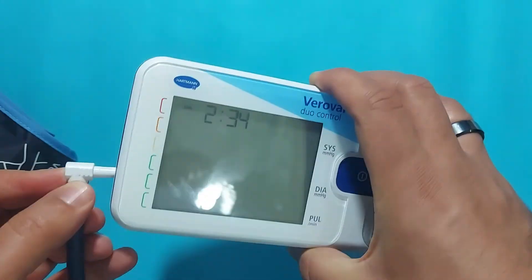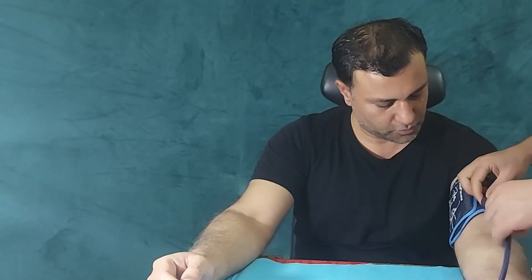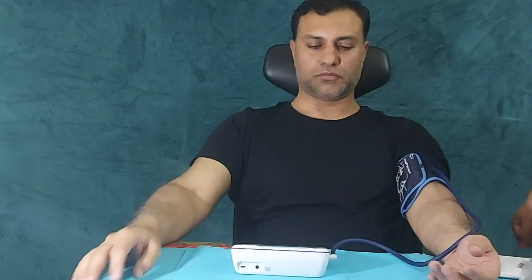Connect the tube to the monitor and you're ready to take blood pressure measurements. Place the inflating cuff at least 2 cm above the elbow and keep the tube in the middle of the arm. Sit back and relax your body, because this BP monitor can detect incorrect sitting positions and alert you about it.